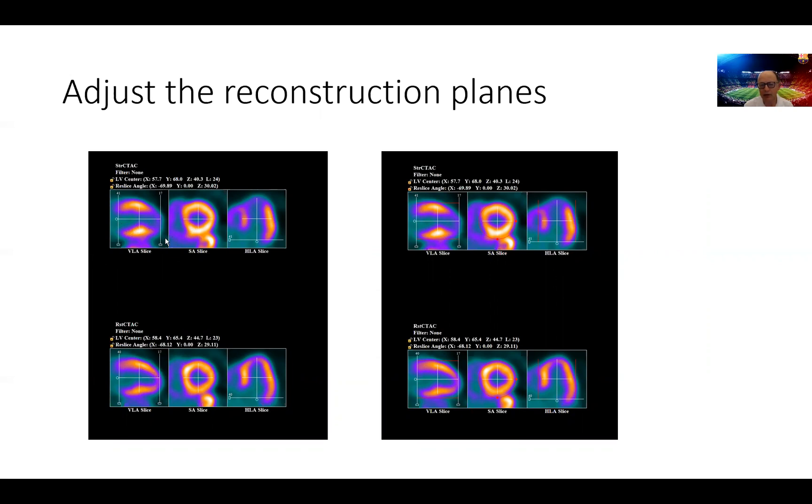The cutoffs are again where the heart margins end, where the left ventricular margins end. And once we do that, we choose this area of interest and limit the area of analysis to the LV cavity, as is depicted on the right-hand side here.